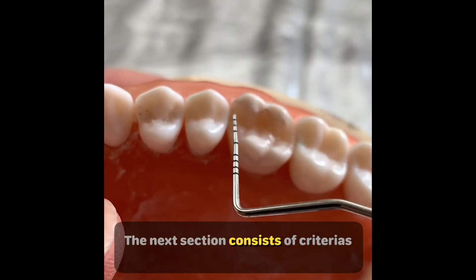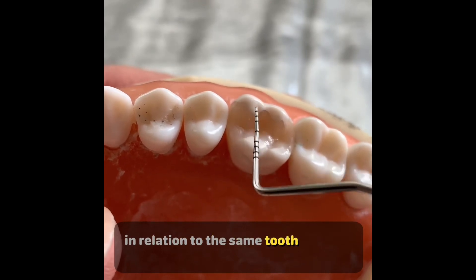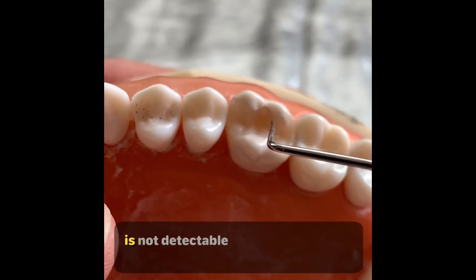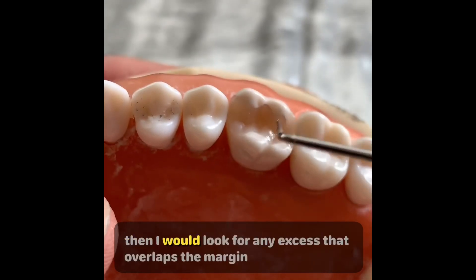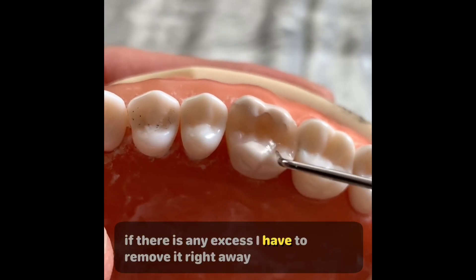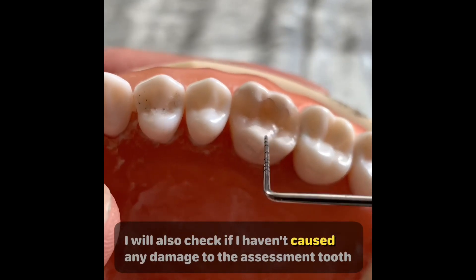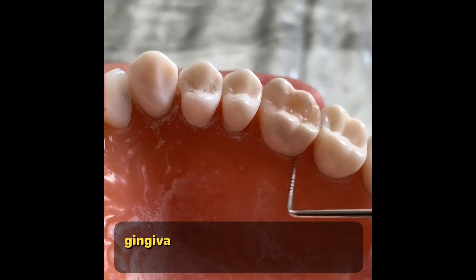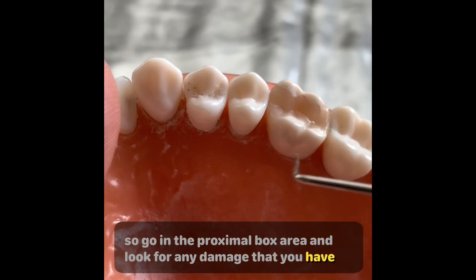The next section consists of criteria that involve restoration in relation to the same tooth. We have to make sure that the junction of tooth and restoration is not detectable or just slightly detectable. Then I would look for any excess that overlaps the margin — if there is any excess, I have to remove it right away. I will also check if I haven't caused any damage to the assessment tooth or the surrounding gingiva, so go into the proximal box area and look for any damage.